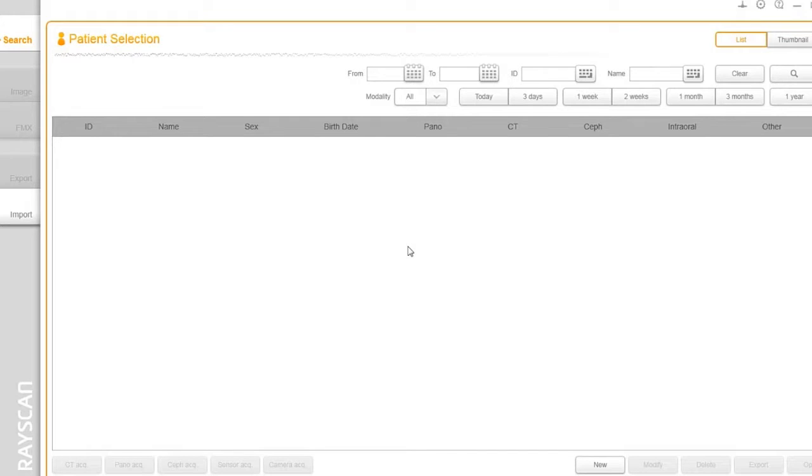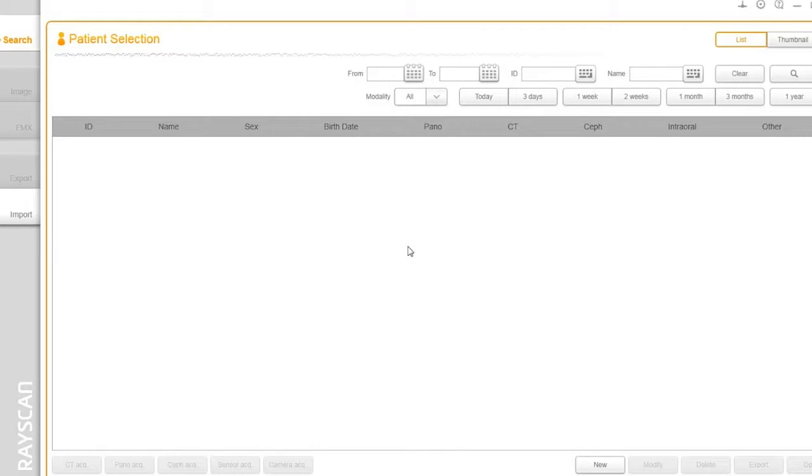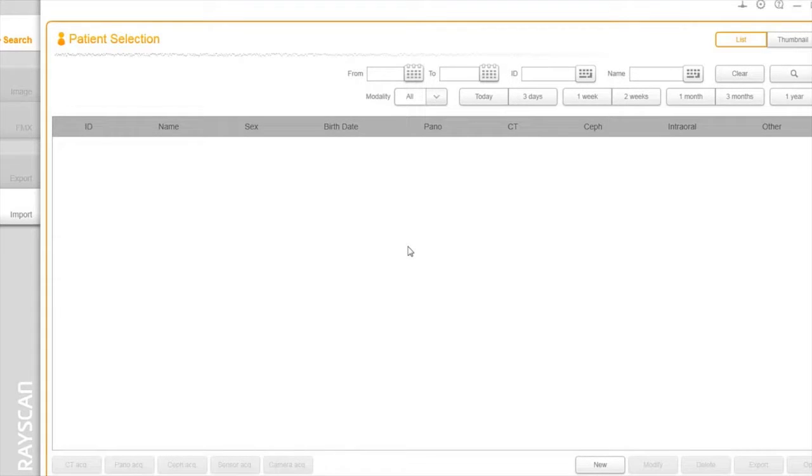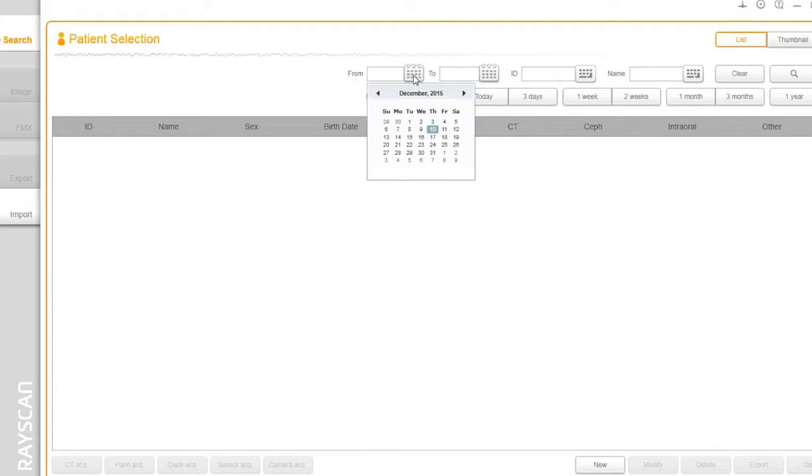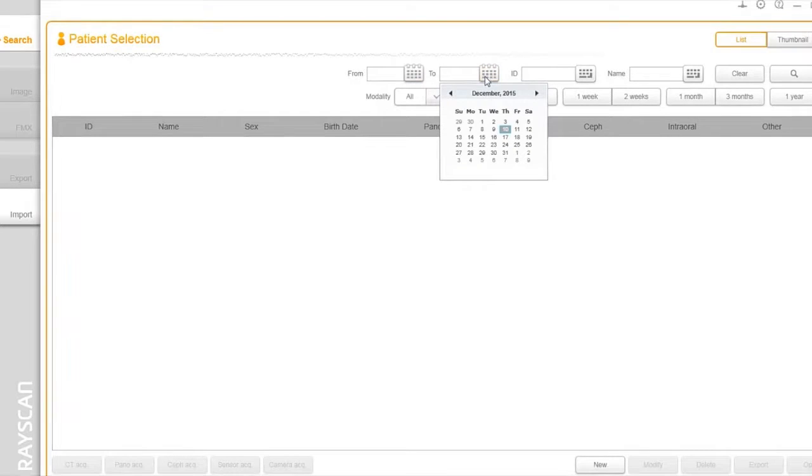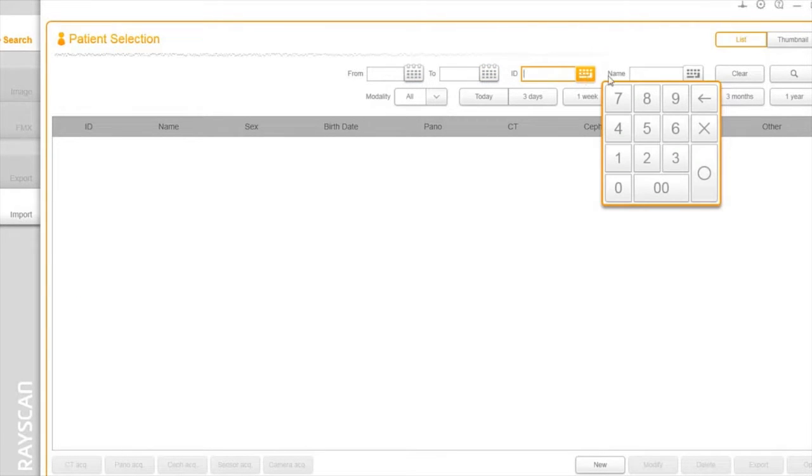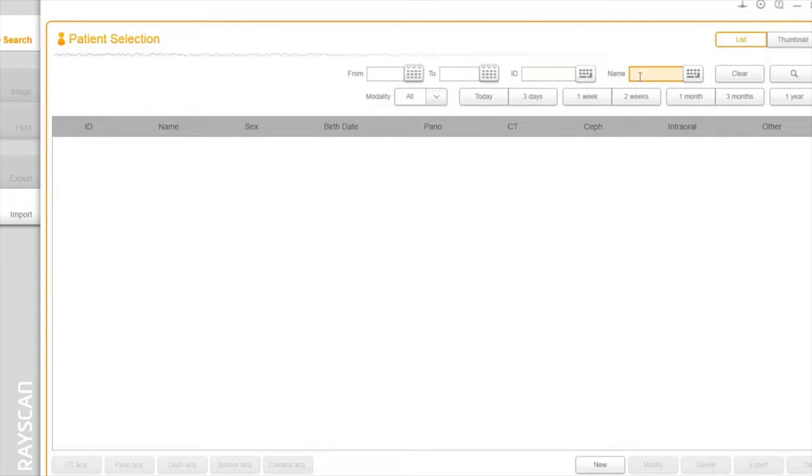Let's dive right into the RIO view software user interface. RIO view is designed to provide as much screen real estate as possible for capturing, manipulating, and enhancing images. Let's highlight some of the important areas you'll be using. This is the main navigation to search patients inside of RIO view. You can search by a specific date, ID, patient's name, and dates.